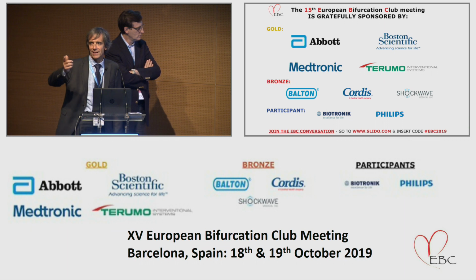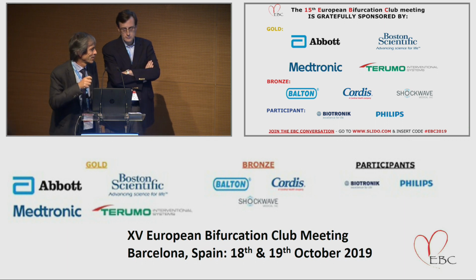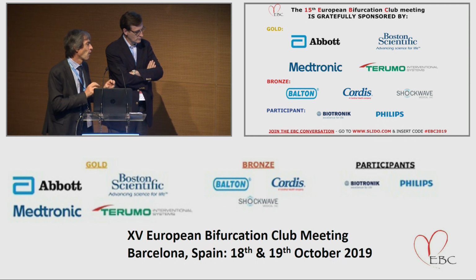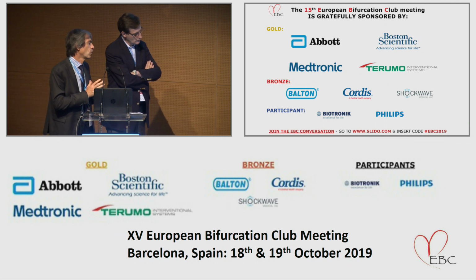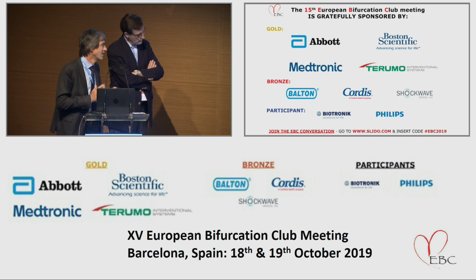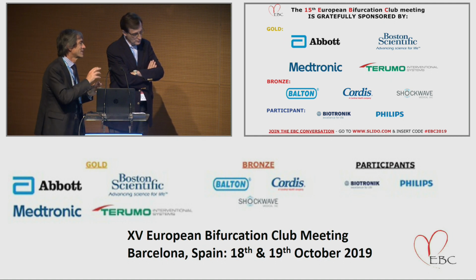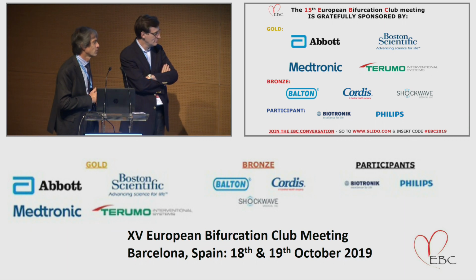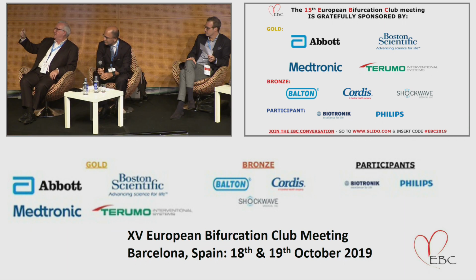So I inserted it in the last slide, not entering, you are right, the detail of which double stenting technique has been used. But I think it's correct to go through intravascular imaging optimization, yes or no. Because if we enter the various strategies, we cannot have enough data. Thrombosis, thickness, and overlapping. Absolutely. So if you put 3 layers of metal, even if it's well compressed and completely crushed, you still have 3 layers of metal. I absolutely agree.